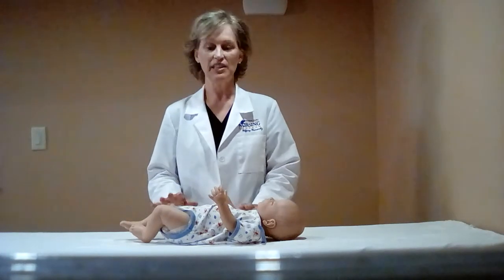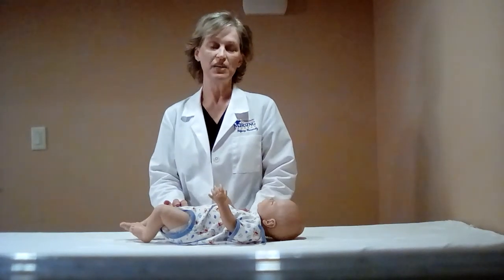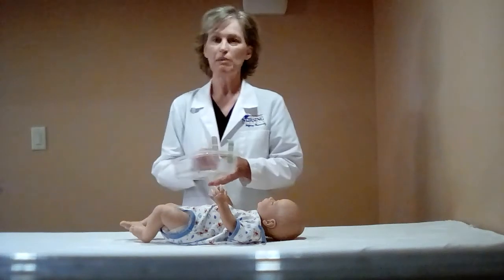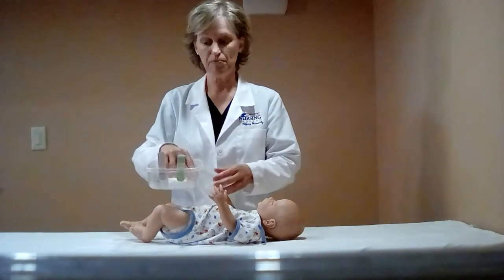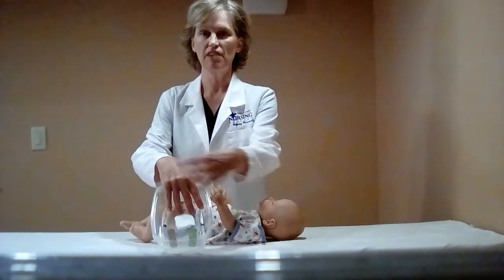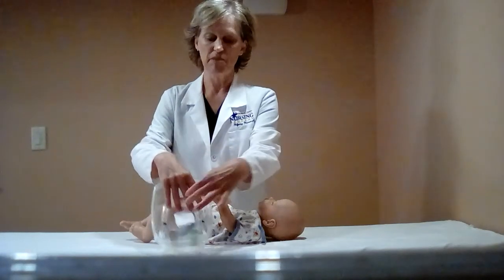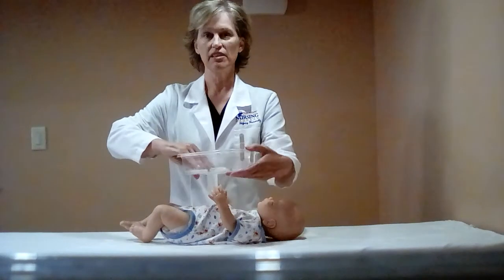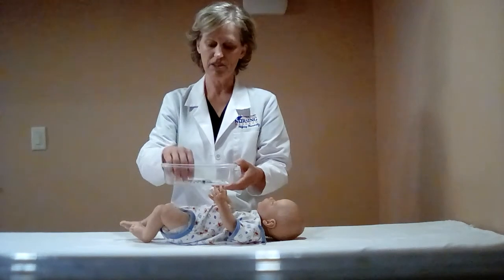Now let's focus on giving a child an injection similar to what you will be doing in the pediatric office. You will be preparing a tray with the immunizations in the medication room. It'll be a tray similar to this, in which we will put the syringes filled with the vaccines in the tray on each side, with the supplies in the middle and Band-Aids on the one end. This is to represent the baby so that we can anticipate where we are going to give the injections.